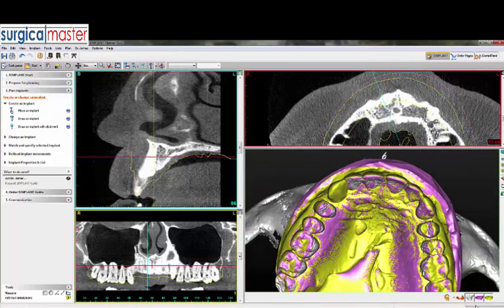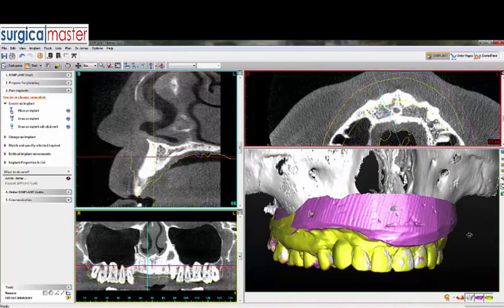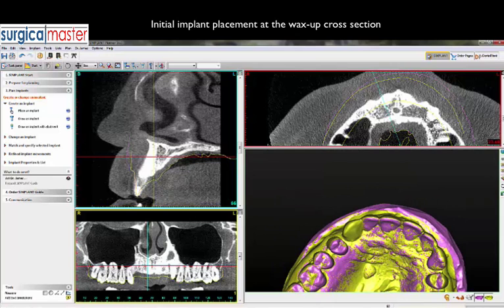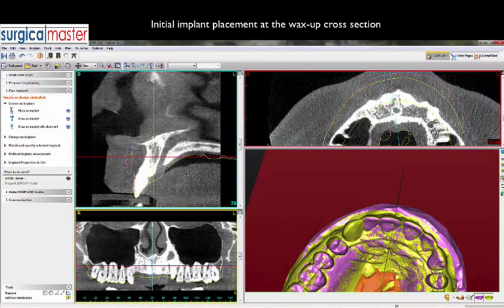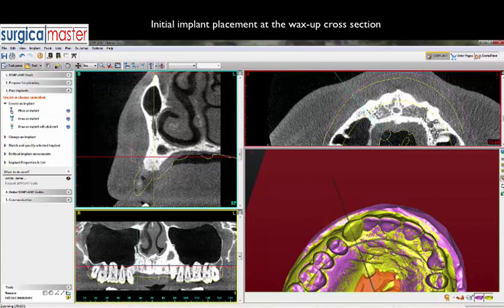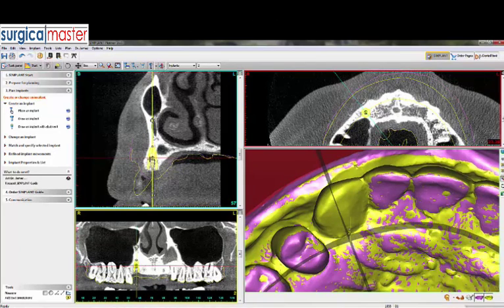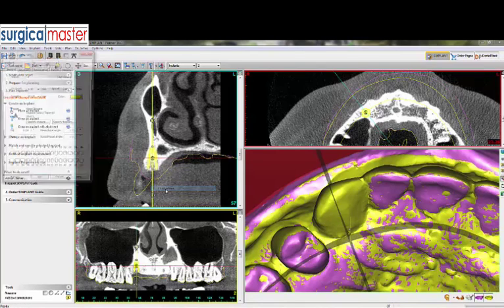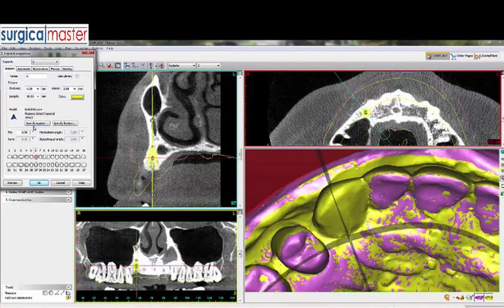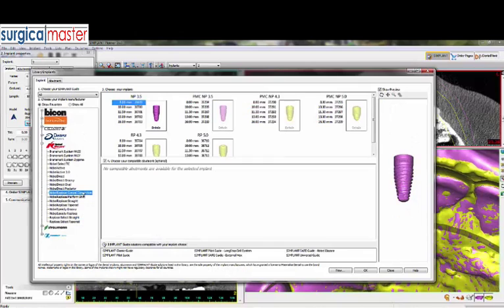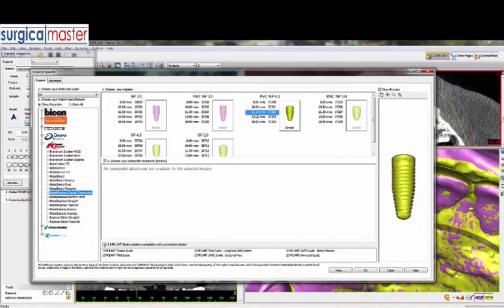Next, I'll turn off the 3D rendering as it's not relevant at the moment, and go to a section through the wax-up — the number 6 wax-up, visible on the lower right side. I'll arbitrarily place an implant in this area. The software picked a 4.3 millimeter implant. I'll change the properties: mark it as number 6, choose an implant with a conical connection, 4.3 diameter and 11.5 length — this is arbitrary at the moment.